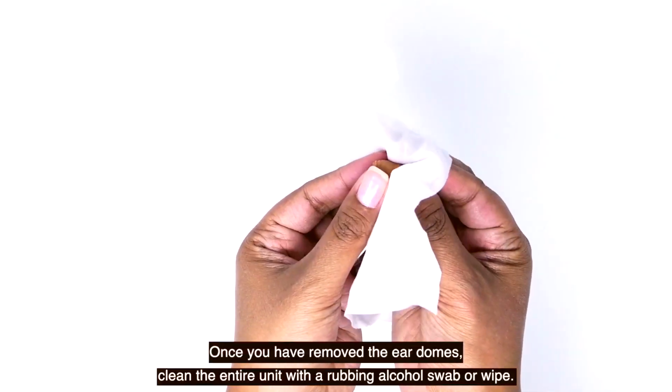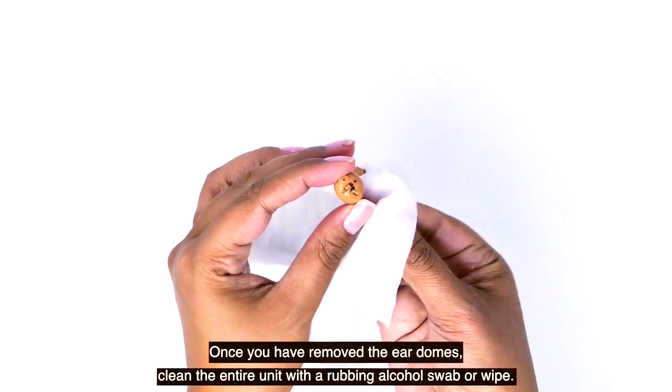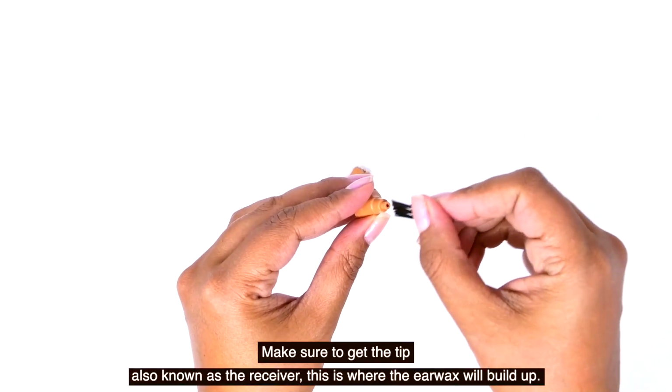Once you have removed the ear domes, clean the entire unit with a rubbing alcohol swab or wipe. Make sure to get the tip, also known as the receiver. This is where the earwax will build up.